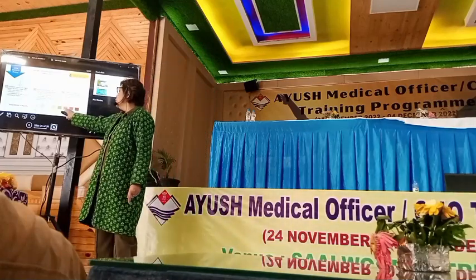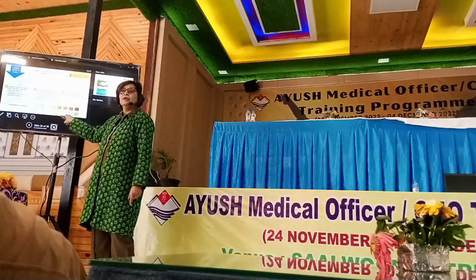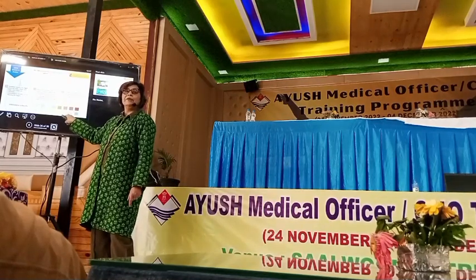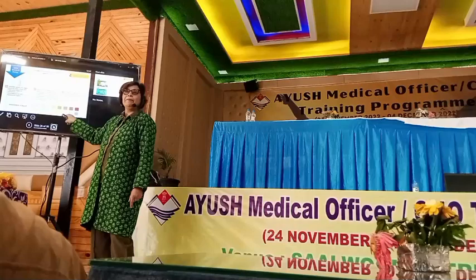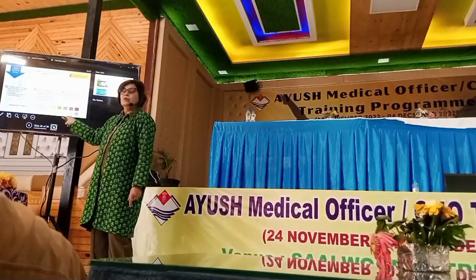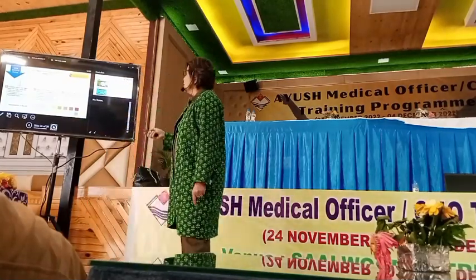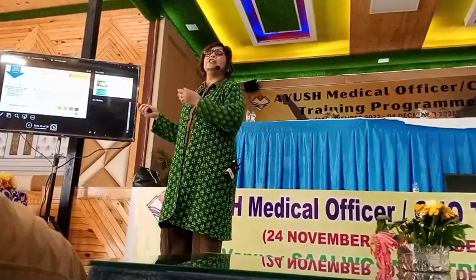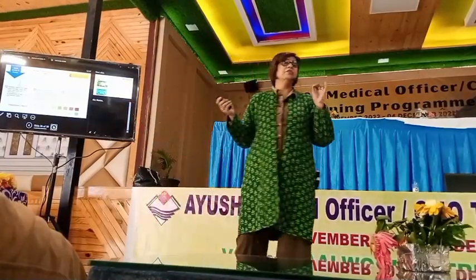इसमें अगर आपका ग्लूकोज आ रहा है और कीटोन्स आ रहा है, ग्लूकोज 4+, 5+ आ रहा है, कीटोन्स आ रहा है, you know where the patient is heading. A diabetic patient is heading. Okay. So this is for urine. So this is, I think, one kit that all of you have, and it's a wonderful thing to have this thing because so many things you can diagnose with it.